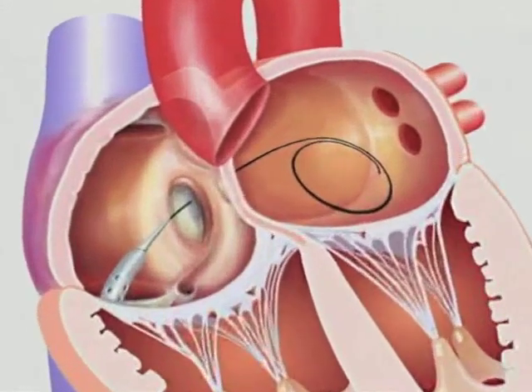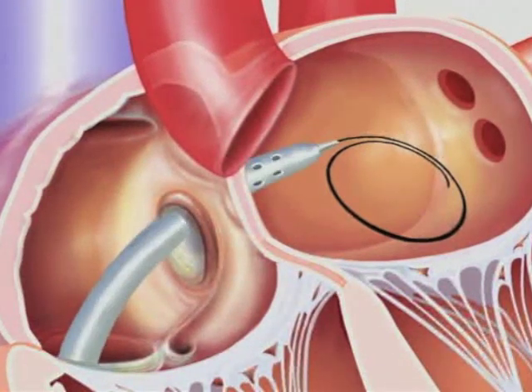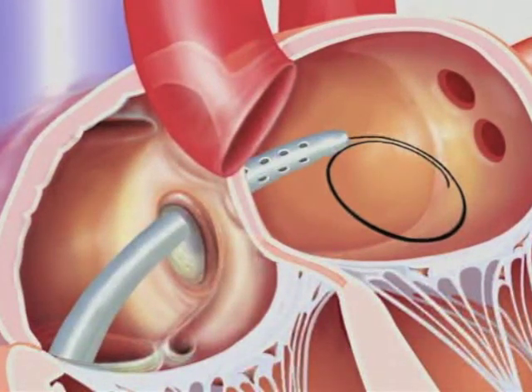Insert the obturator cannula assembly over the guide wire into the left atrium. Confirm position of the tip of the transseptal cannula inside the left atrium using fluoroscopy, pressure transducing, blood gas analysis, or echocardiography.